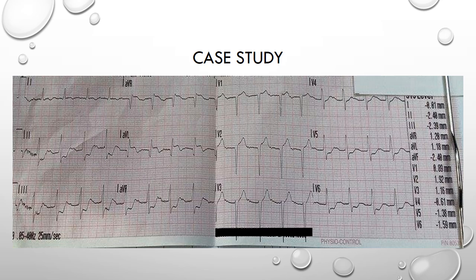The most obvious finding we see from this ECG is the ST depression in the inferior leads of 2, 3 and AVF, and also in the left-sided leads of V4 to V6, and we can see that there. So what's going on?